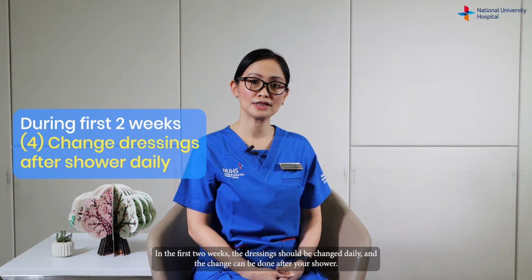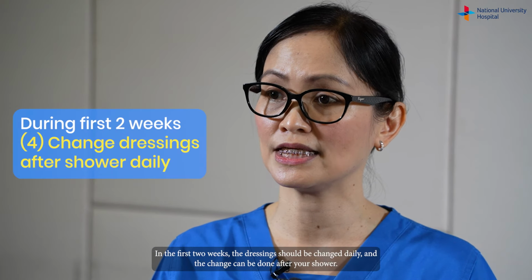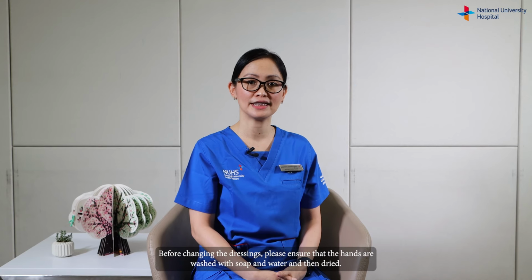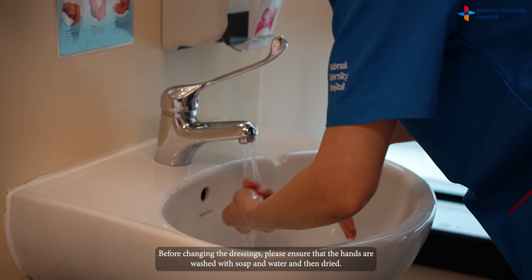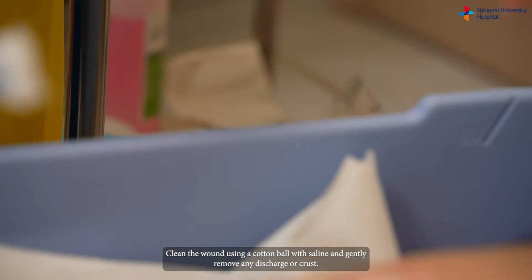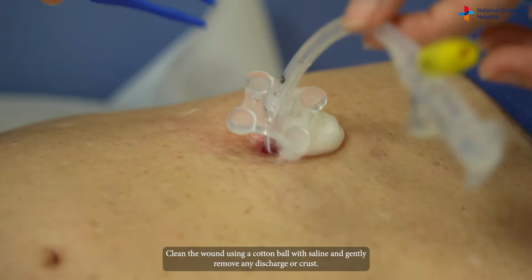In the first 2 weeks, the dressing should be changed daily, and the change can be done after your shower. For the dressing of the wound, you will need a disposable dressing set, normal saline, and a tape. Before changing the dressing, please ensure that the hands are washed with soap and water and then dried.